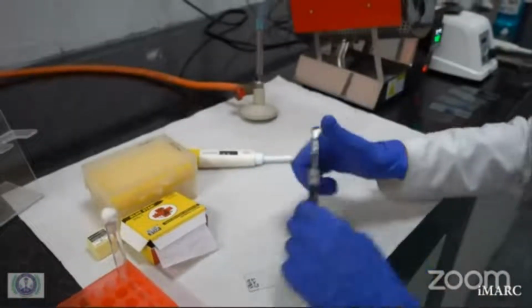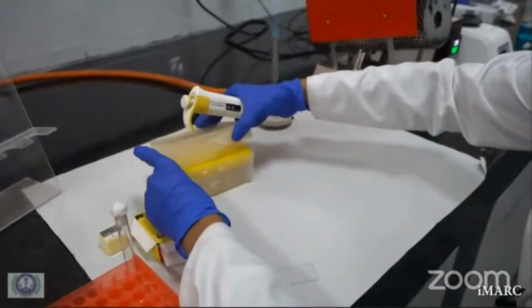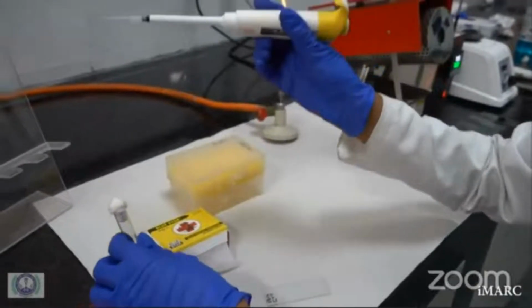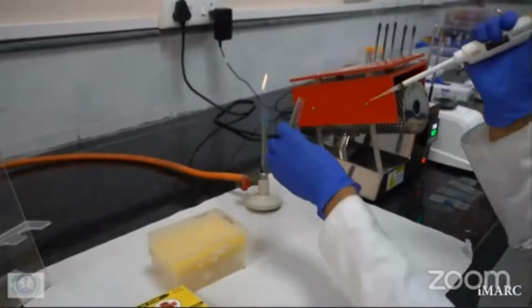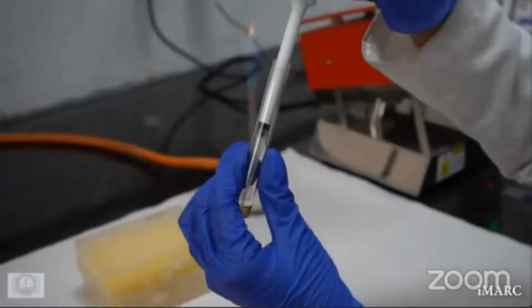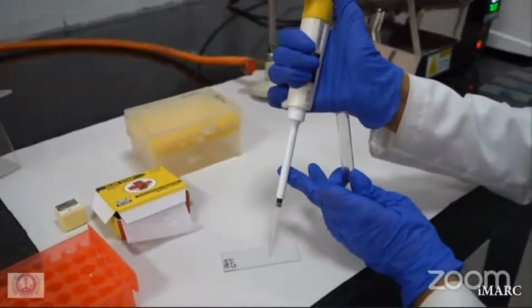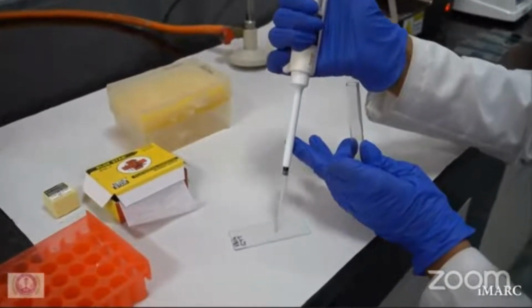We make a very light suspension of the test organism in 0.5 ml of sterile pooled human serum and incubate at 37 degrees Celsius for exactly 2 hours. Then, after incubation, place one drop from the incubated serum on a slide with a cover slip and observe under the microscope for production of germ tubes that represent initiation of hyphal growth arising directly from the yeast cell.